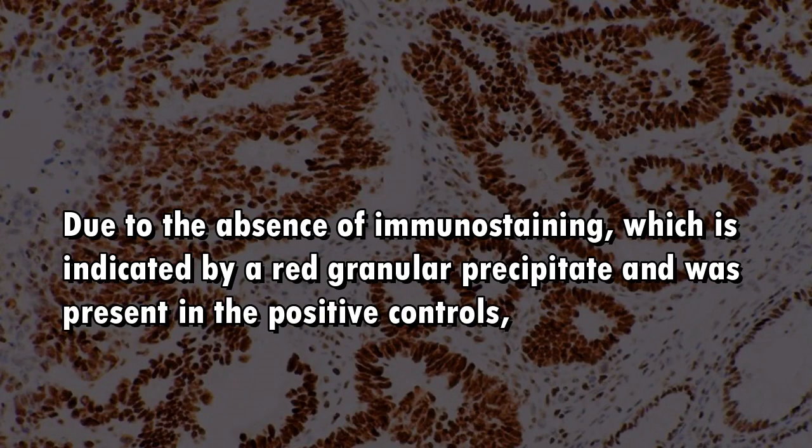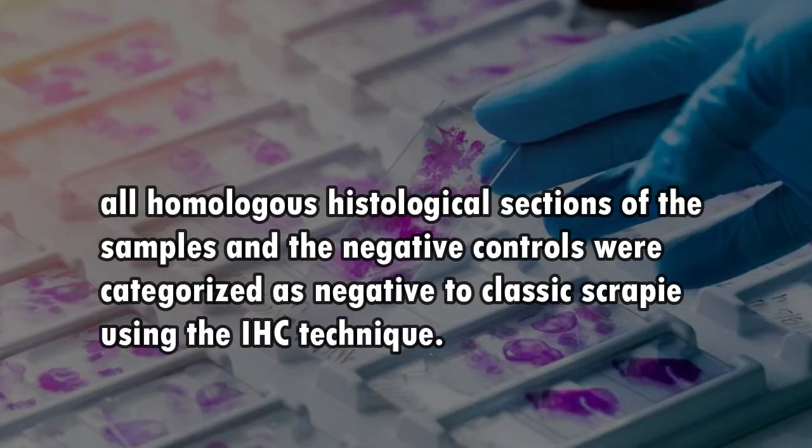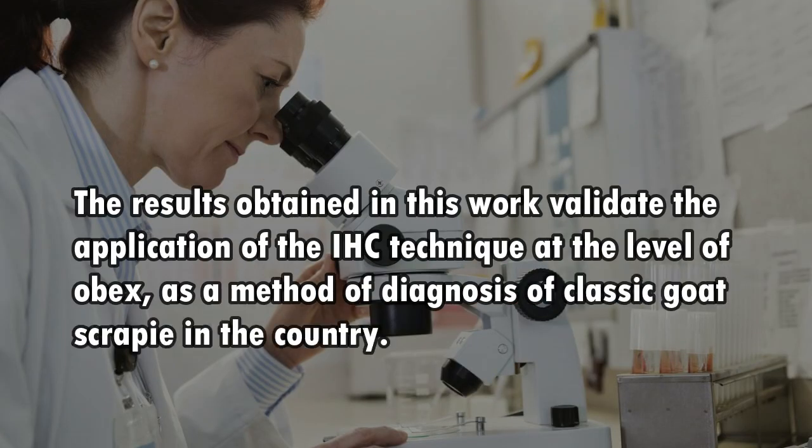Due to the absence of immunostaining, which is indicated by a red granular precipitate and was present in the positive controls, all homologous histological sections of the samples and the negative controls were categorized as negative to classic Scrapie using the IHC technique. The results obtained in this work validate the application of the IHC technique at the level of the obex as a method of diagnosis of classic goat Scrapie in the country.